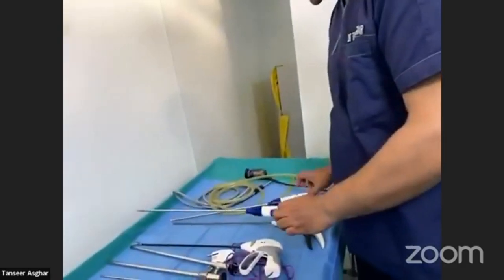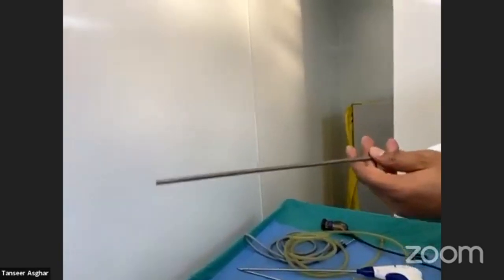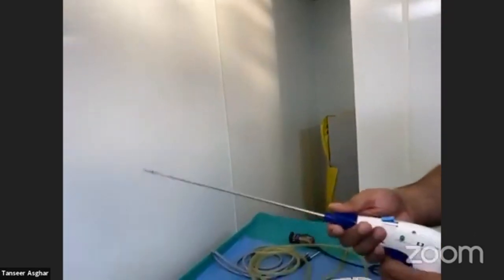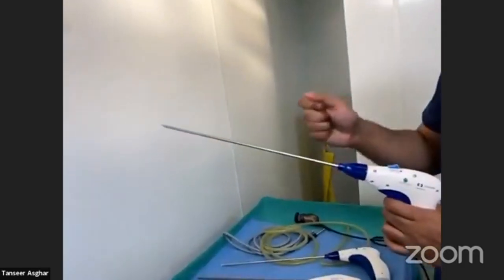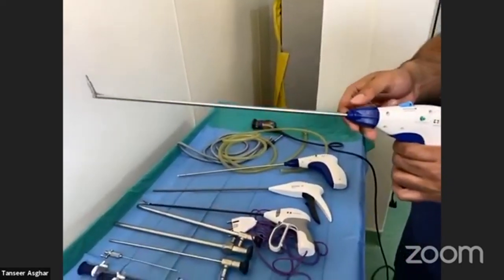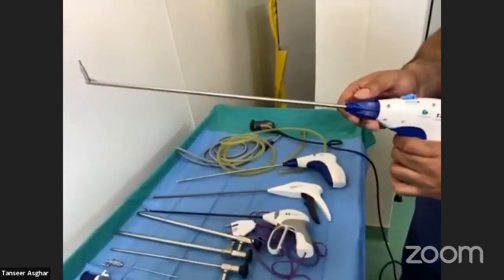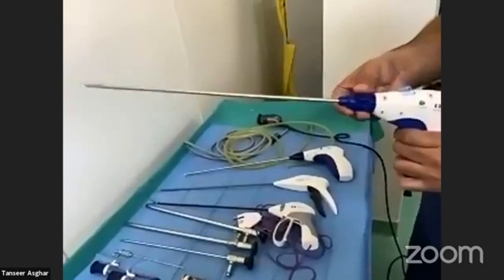This is also an important disposable instrument — a tacker used in hernia repairs. This is another tacker used in ventral hernia; it is an absorbable tacker, while the previous one was a metallic tacker. It has roticulating maneuverability up to approximately 120 degrees, which is helpful for tacking the anterior abdominal wall in ventral hernia repairs where angulation is needed.